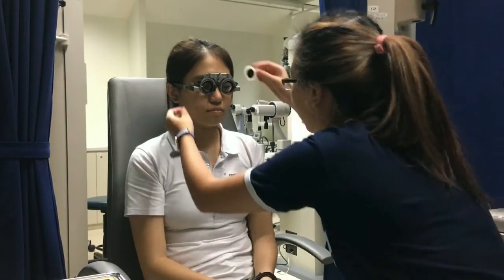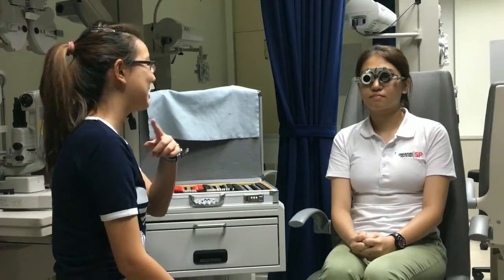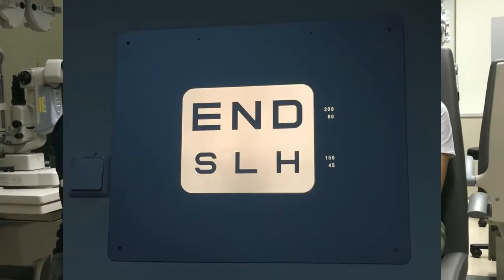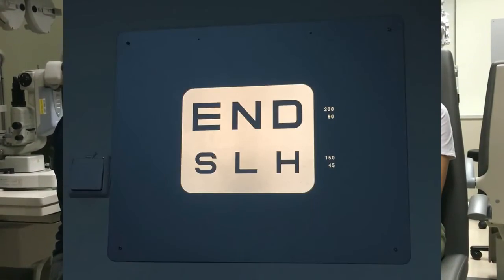Close your right eye. Can you see the big E there? Is it clear? Clear. Very clear. Do you see the first line? A bit. The second line? Okay.